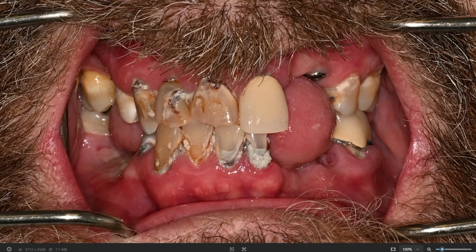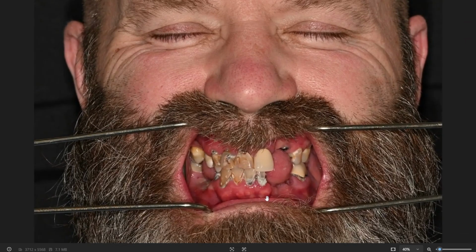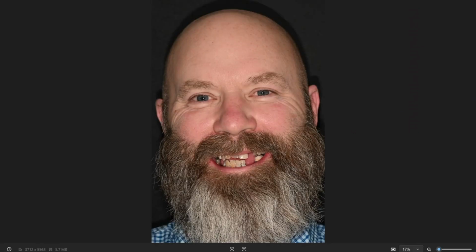So when we're talking about the digital treatment planning and the diagnostic photos, retracted photos are great. I really like to see that smile photo, full exaggerated smile. A lot of these patients, they don't want to smile if they have teeth that kind of look like this, but you can see here with that vertical height of where the existing implants are, that's why we chose to use these implants and incorporate these in the hybrid. So here's the retracted smile, and then we also have a full smile here, and then our full smile.